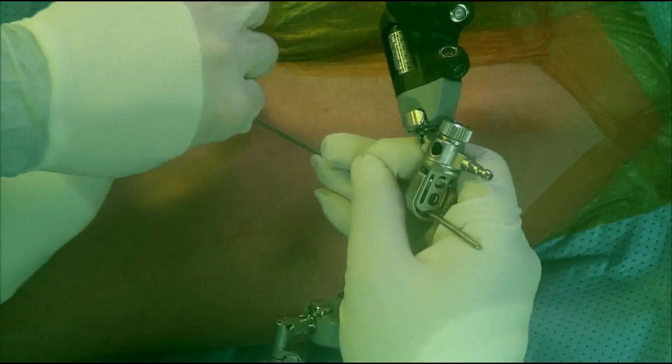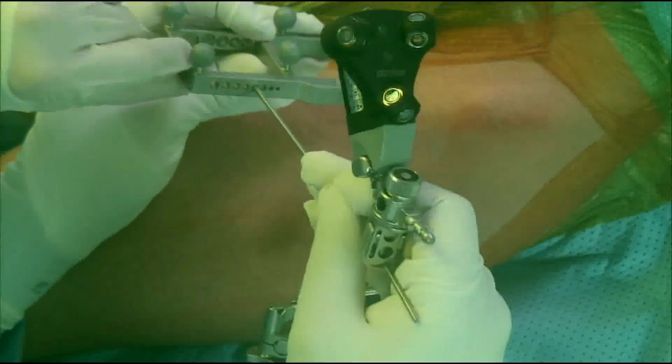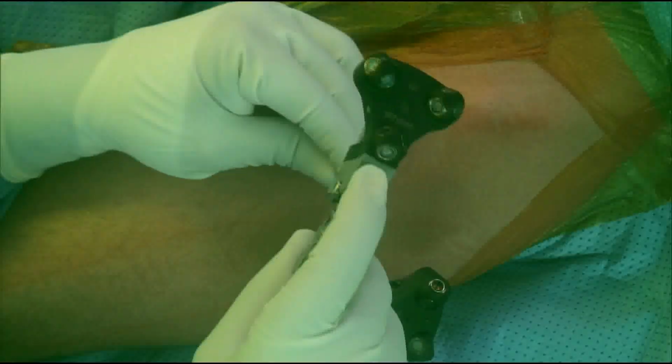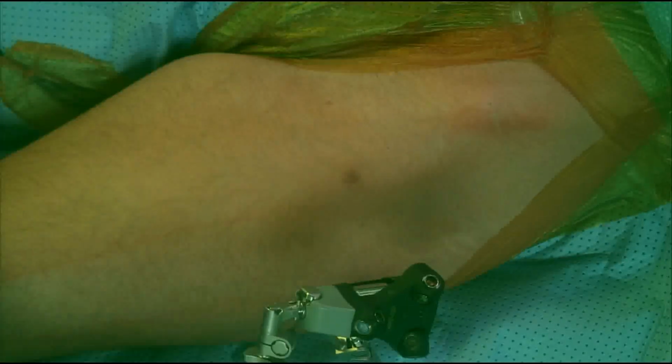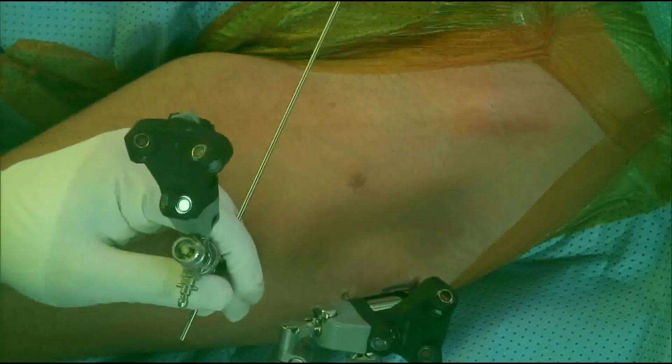using the calibration device. Here we try to identify how far the tip is from the Ingenious tracker system and the size of the wire that we used. Once we finish this process, the next step will really be to identify the accuracy of our system again.